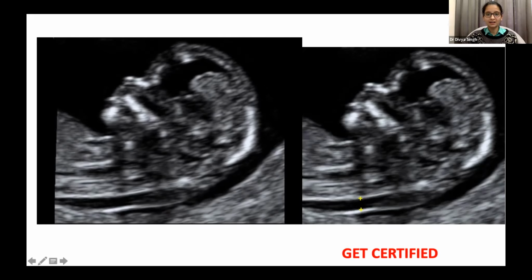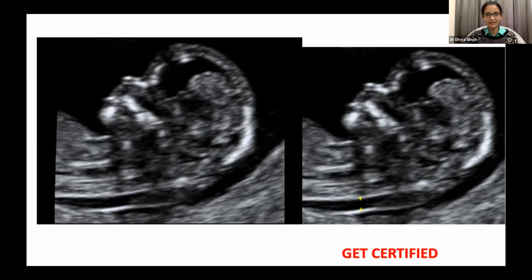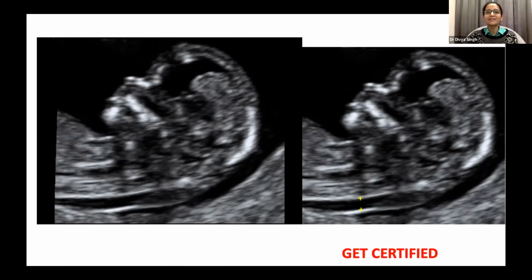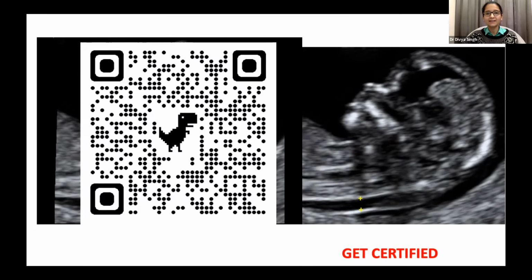Before you actually start measuring NT, it's a good idea to get certified so that you know what you're supposed to do and that you are a safe scanner. And this is a QR code of the Fetal Medicine Foundation UK site, where you can do the theoretical course on NT, submit a logbook of images, and become a certified NT operator before you start scanning.